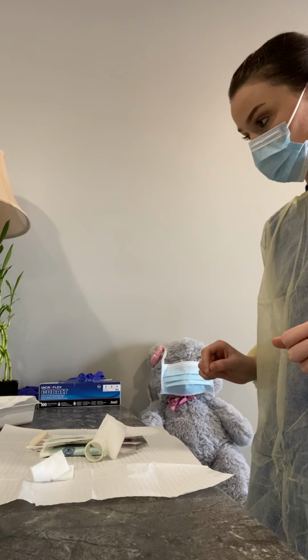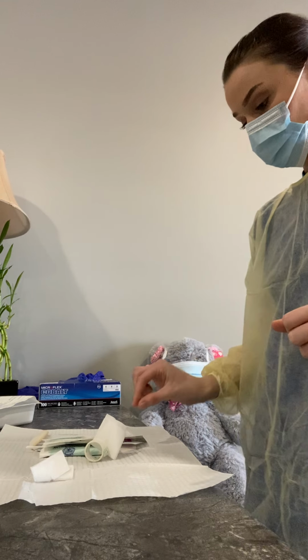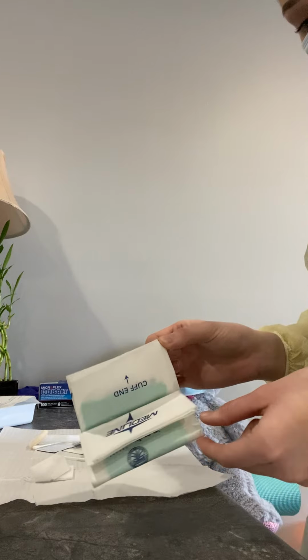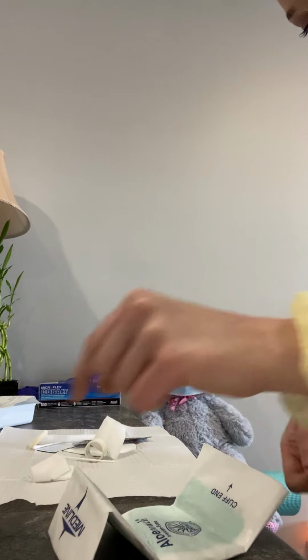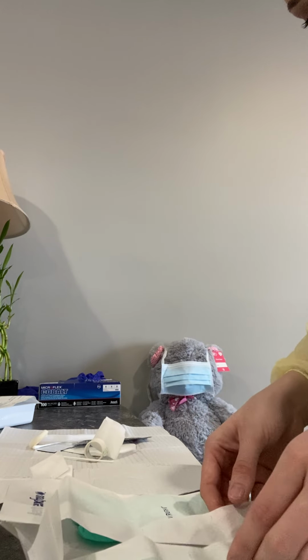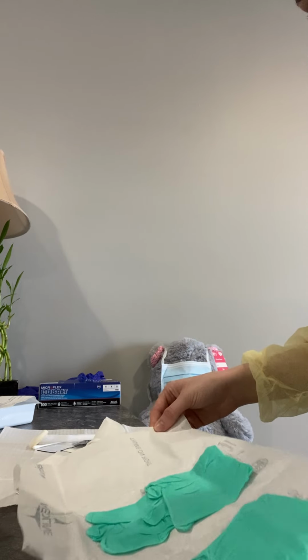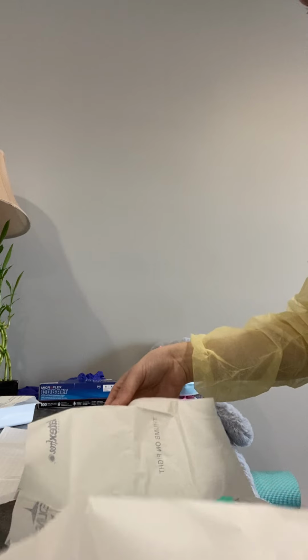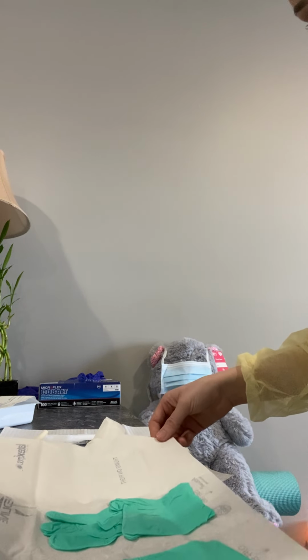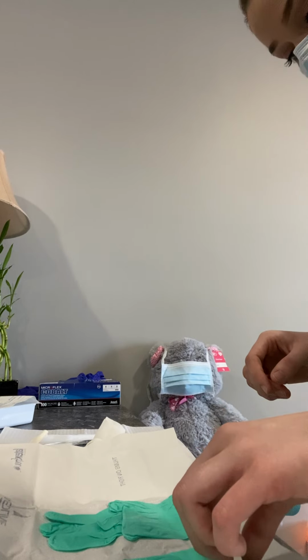Let's see where I'm going to put on these sterile gloves. All right, I'm going to grab these. Put them on right here. All right, so I'm going to put on my sterile gloves. Okay.